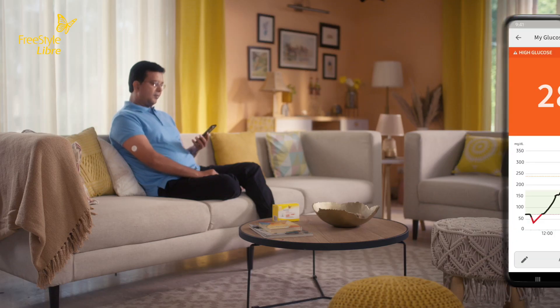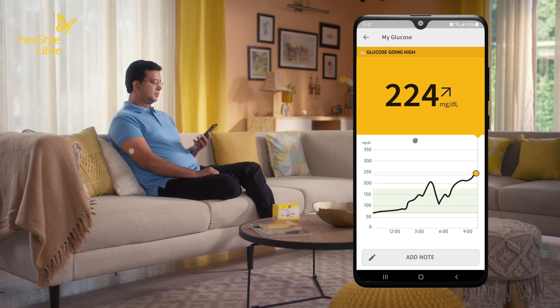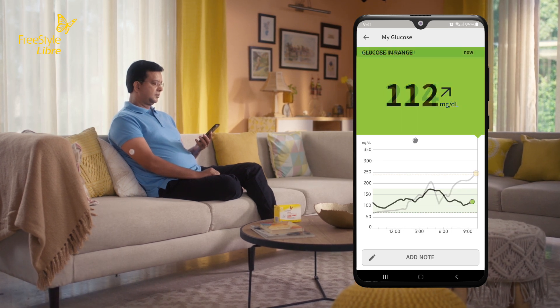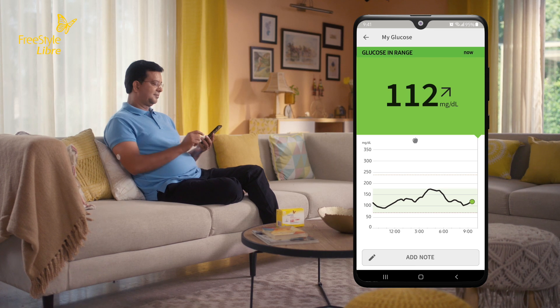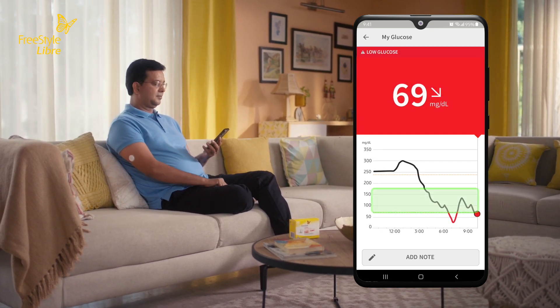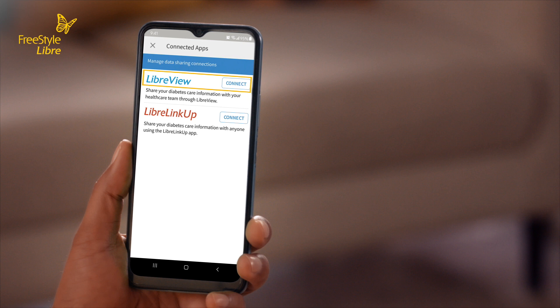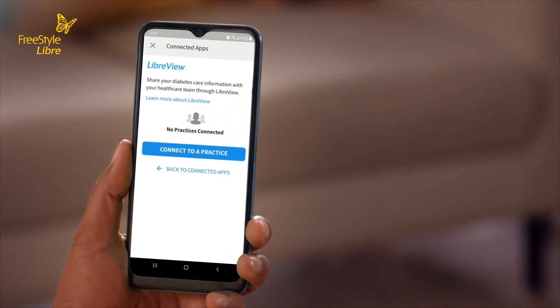You will also notice there are different background colors. Your current glucose value determines the background color. Orange means your glucose is high. Yellow means you are above or below your target glucose range. Green indicates you are within your target range, and red means your glucose is low. You can work with your doctor to set your personalized target range.